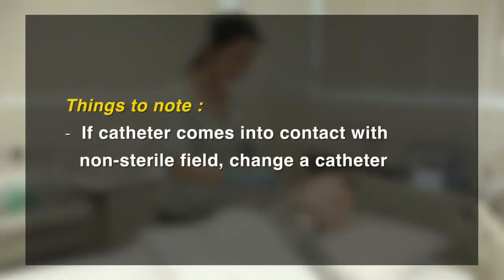If the catheter comes in contact with a non-sterile field — for example, skin, mouth, clothing, water, or tissue paper — change to a new sterile catheter.